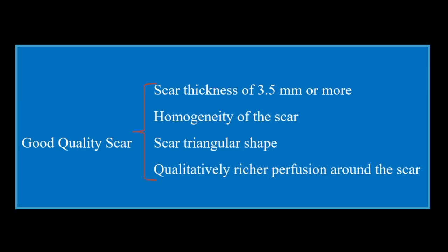A good quality scar has optimal thickness of about 3.5 mm or more, is homogeneous, and is triangular in shape. Even if the triangular shape cannot always be demonstrated, absence of ballooning is sufficient. Some studies also note qualitatively richer perfusion around the scar site, though not all machines can demonstrate vascularity at that level. Richer perfusion suggests a more stable and well-integrated scar.